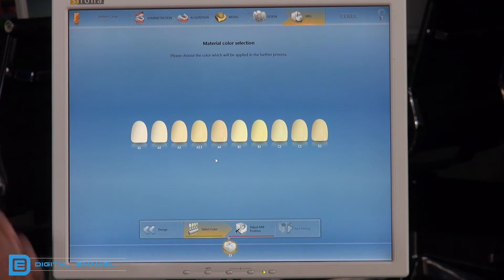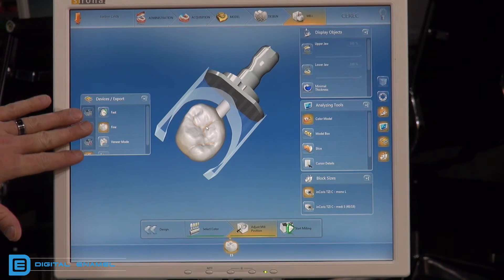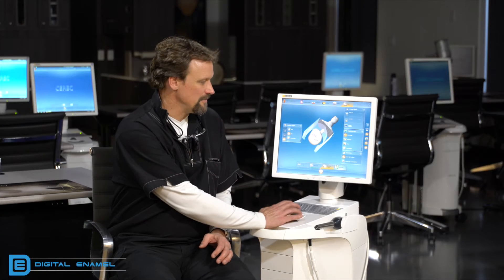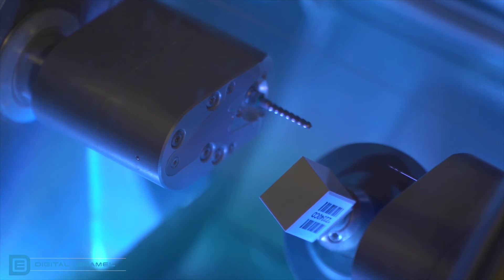When you go to the mill preview stage, you have to select the shade — this is important for the sintering process in the oven. In the mill preview window you'll see the dry milled restoration, and you also need to select whether it's fine milled or fast mode milled. When you go to start milling, you'll need to put in a barcode from the block of zirconia. That barcode helps the Speedfire know exactly how much shrink rate that particular lot of zirconia will go through during the sintering cycle.